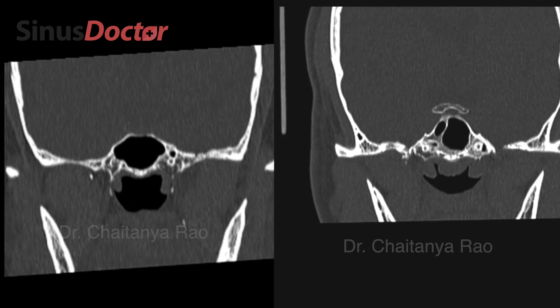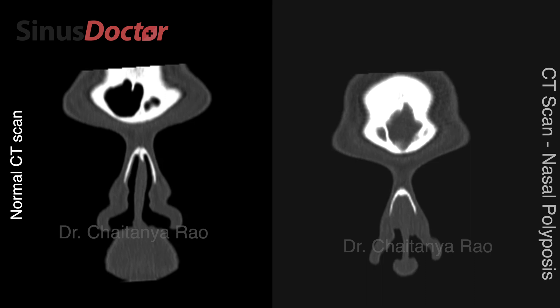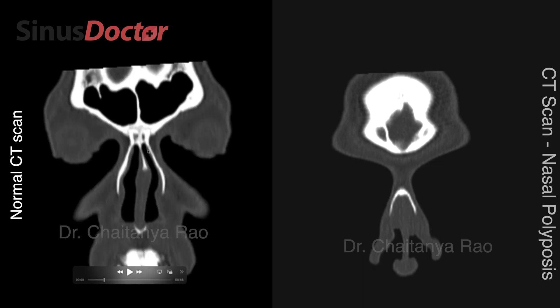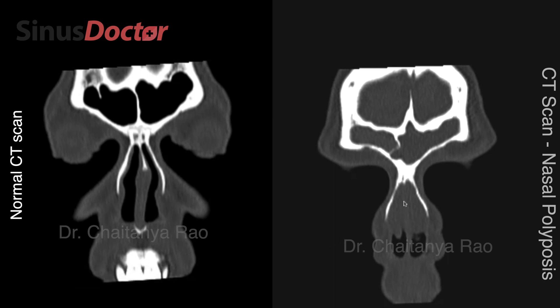Now let us discuss the next case. This is a patient whom I recently operated on — she is a patient having severe nasal polyposis. Coming to the scan: this is the left frontal sinus. These are the frontal sinuses of the normal patient — compare that to the patient having severe nasal polyposis, where you can see both sinuses are completely filled with pus and polyps, with no space for air at all. In a normal scan, there is a black column through which we can breathe. For this patient, the polyps have completely occupied the nasal cavity, and only a very small black column remains through which she can breathe.